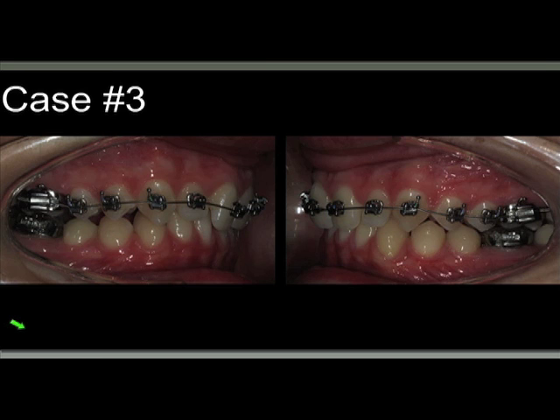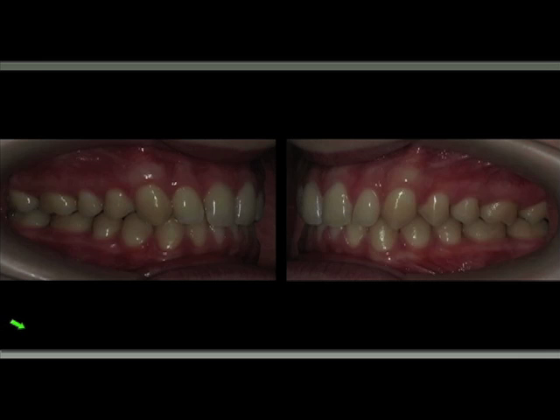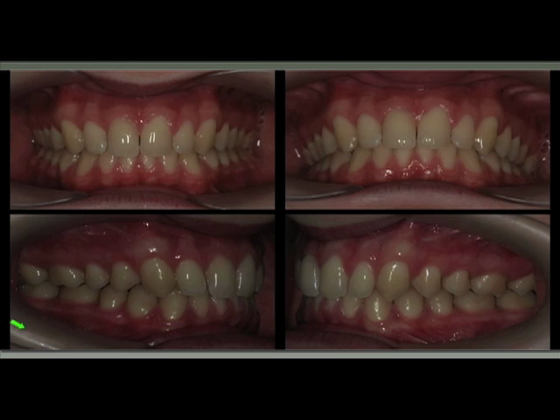You can see also the 45 degree view with the arch coordination. In this case over here, it's a non-extraction class 2 on the right side with a deep bite, and those are the first wires. We upright the molars, we distalize the molars to achieve class 1, and we level the occlusal plane. That's the first wire, and this is the last arch wire, where the occlusal plane is level, the arches are coordinated, and the molars have been distalized on the right side to achieve a class 1. That's the final case after we remove the appliances.